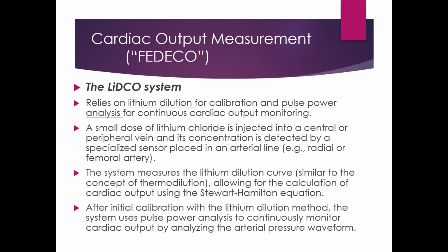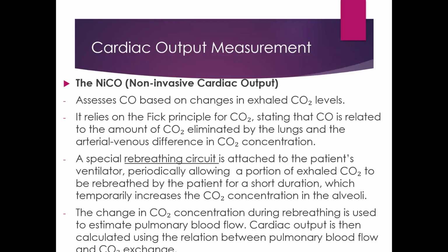The system measures the lithium dilution curve, just like the concept of thermodilution, and it's computed through the Stewart-Hamilton equation. So the first thing is that you need to calibrate the system with the lithium dilution method, and it gives you a continuous measurement of your cardiac output.